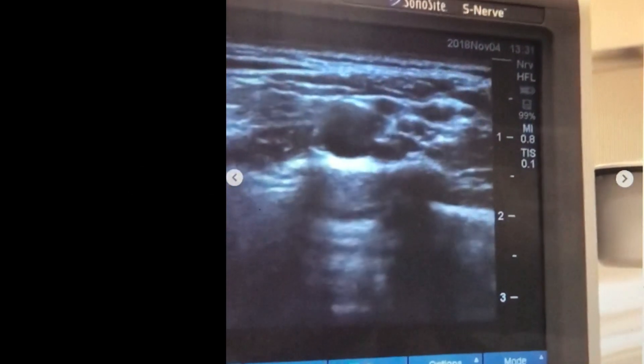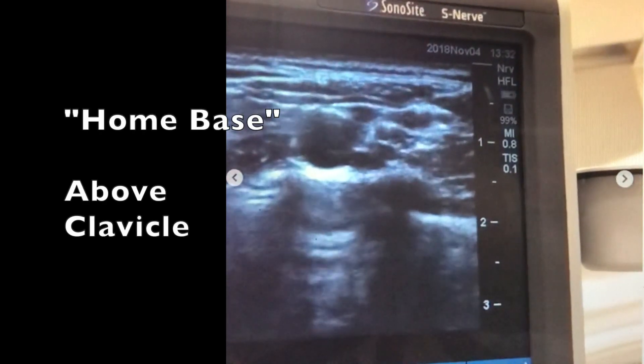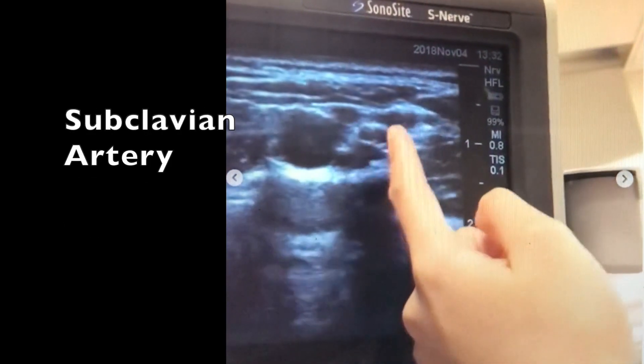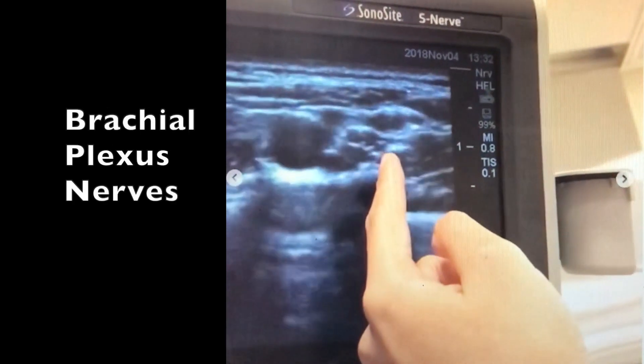Brittany is going to try and find my brachial plexus. This is the home base position, with the probe above the clavicle. You want to find the subclavian artery, which is the dark circle that's pulsating. Then to the right of it, these darker, smaller circles — kind of a bundle of grapes — those are the nerves.